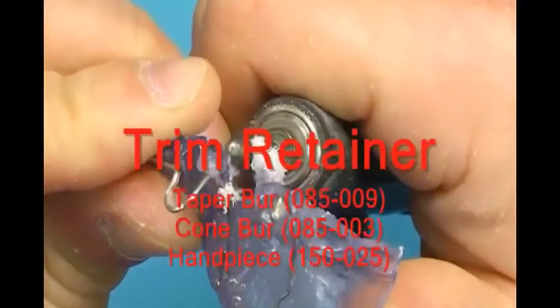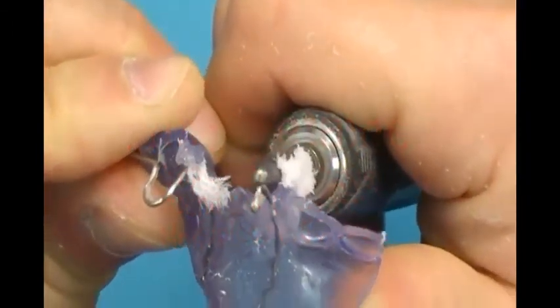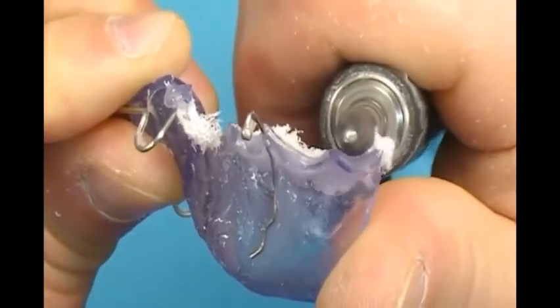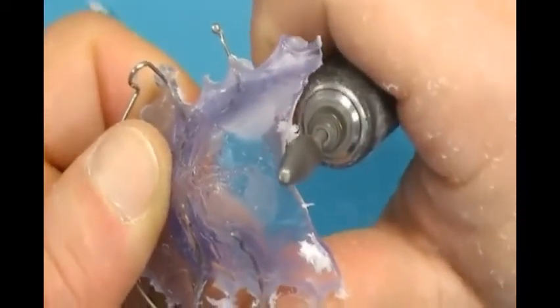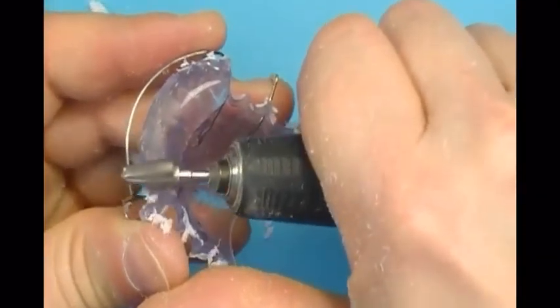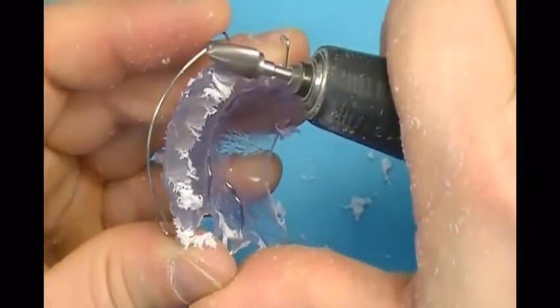With the taper burr and lab handpiece, the posterior segment is scalloped 1½ millimeters above the gingival margins to rest against the cervical crowns of the posterior teeth. The back or heel of the retainer is often tapered forward near the mid-palatal area. Maintain plastic contact against the last tooth on each side of the arch and taper acrylic forward about 1/4 of an inch.